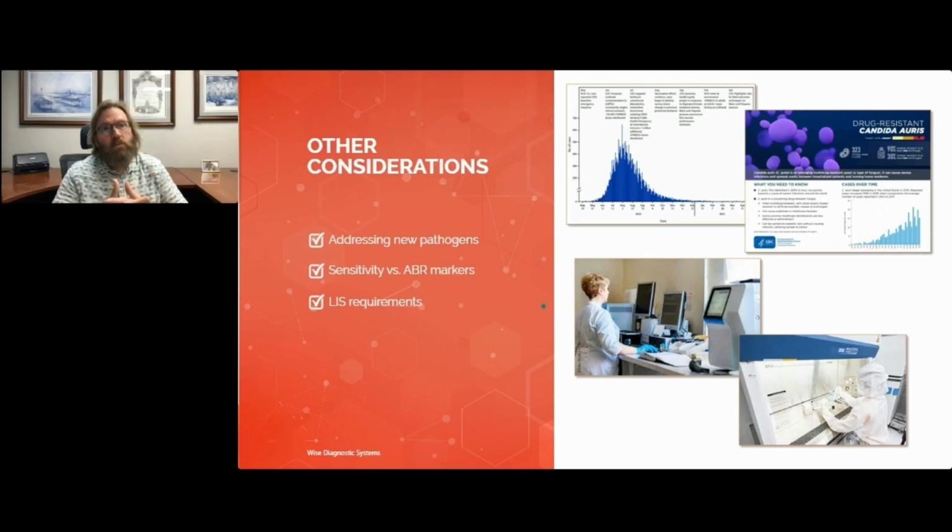The other thing to consider, and this can actually be a more technical one, is that if you have not already been dealing with molecular pathology, take a look at your LIS systems to make sure that they offer that type of testing, or that they have the ability to build in those types of testing for you. My experience has been that when bringing on a product in general, or a new test menu item, or a service, or even just making a change, the clinical lab staff out there are very, very good at doing their validations in a very, very succinct timeline.